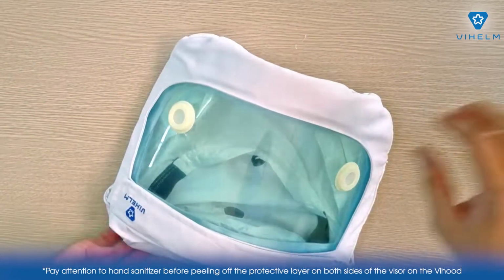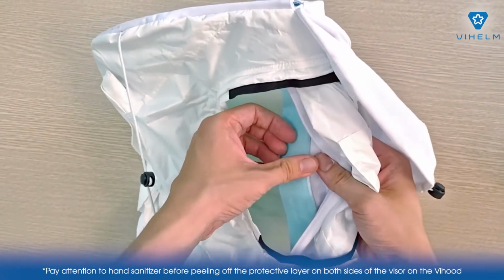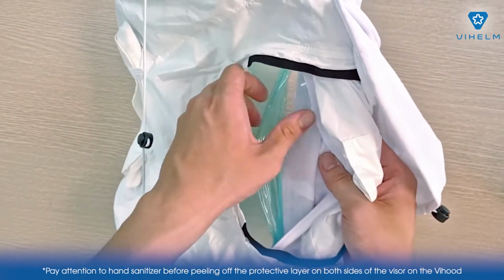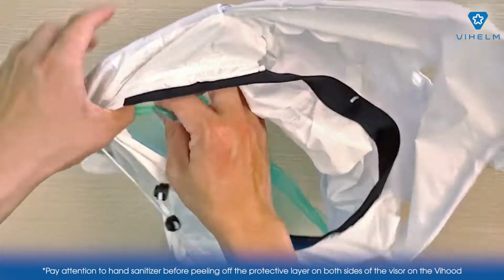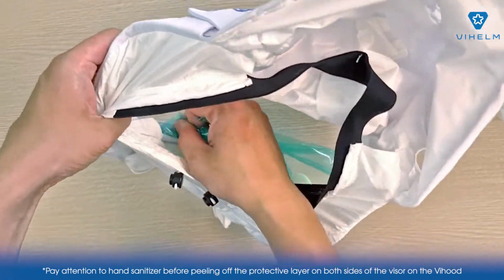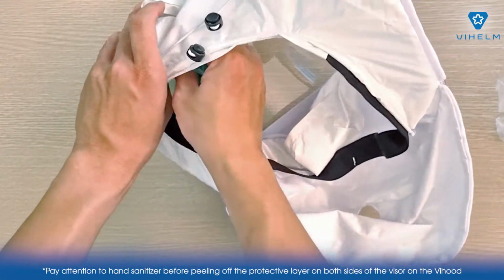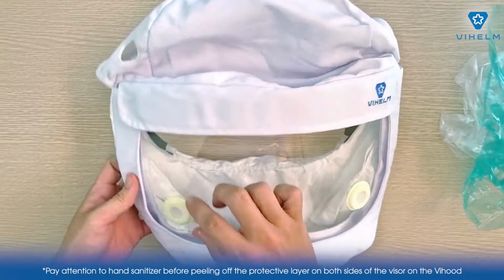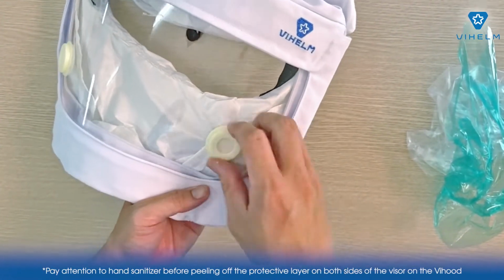Step 4. Similarly, peel off the protective film on the inner visor of the Vihood. Step 5. Tighten the exhale filter holder. Make sure the filters in the exhaled filter holder are securely closed.